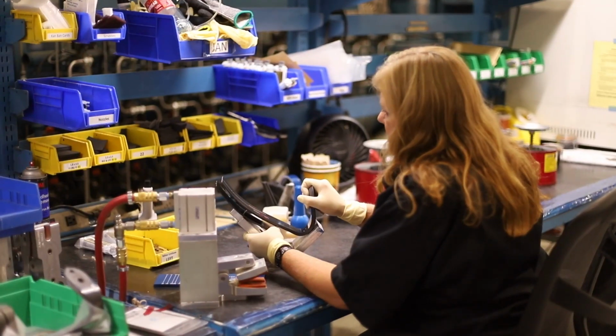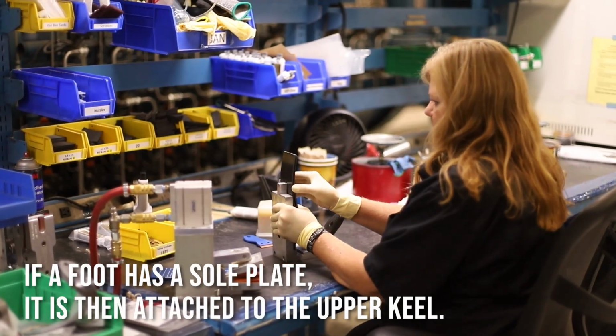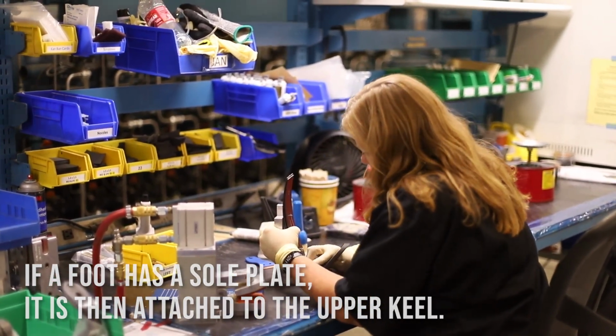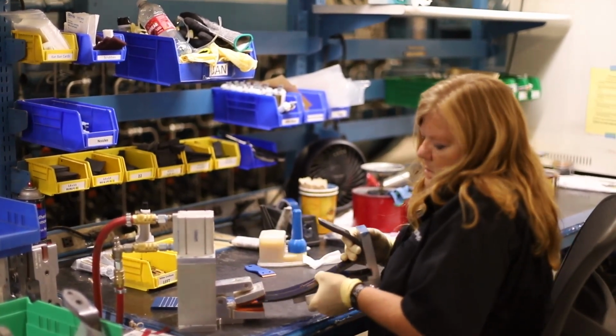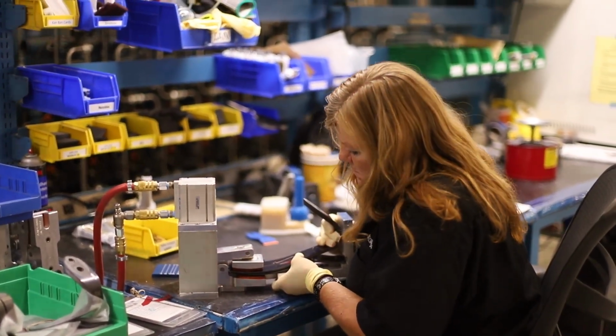Correct. Yeah, so what she's doing right now is bonding the upper component, or the keel component, to the lower component or the sole plate. And once she gets that bonded, then that specific foot will go in and get the water jet toe cut, just like we just saw.